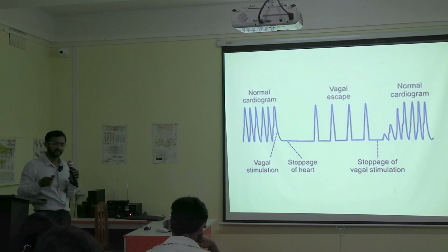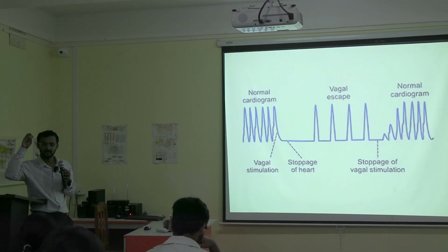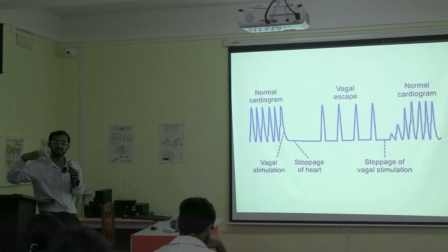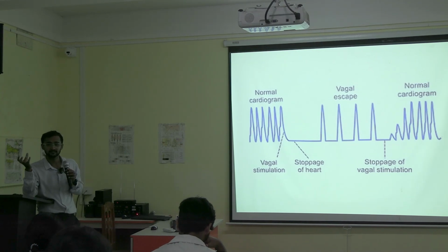When the impulse is generated from the pacemaker, the sympathetic activity has its positive inotropic and chronotropic effect, but the vagus nerve has a negative effect. So this will reduce and there is a balance. As a result, we are getting the heart rate of the frog around 25. Why are we getting that heart rate?